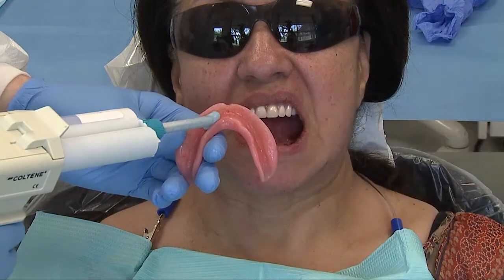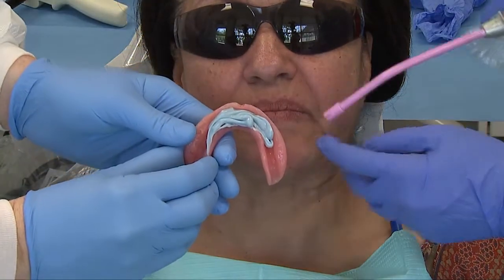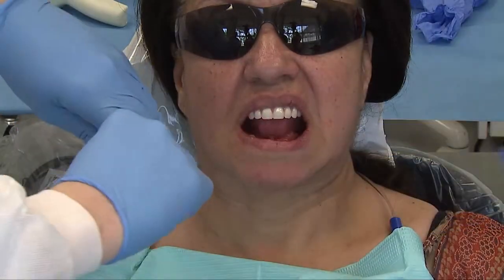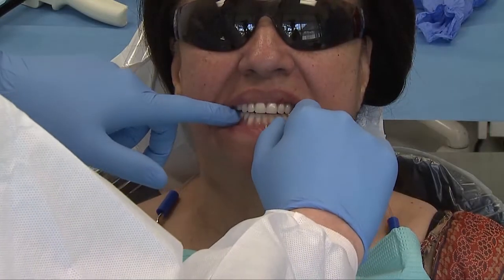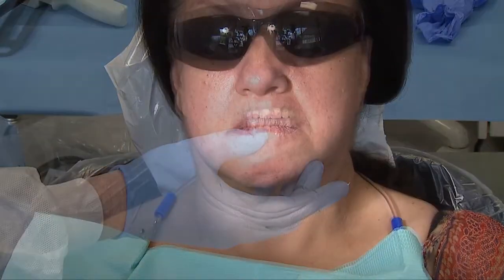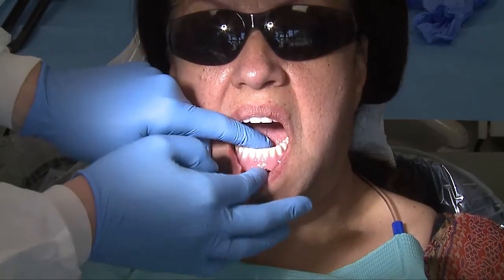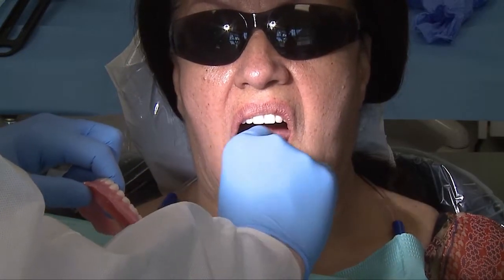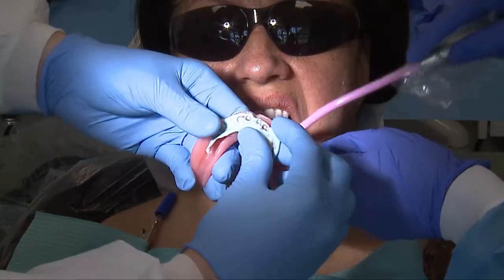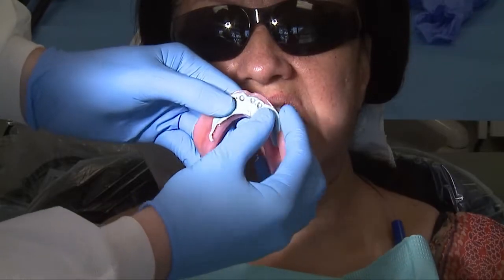I'm going to inject it into the area that corresponds with my locator abutments. Seating it, and have the patient bite down normally. Step number one: have her open, and this should be completely set. Sometimes it will stick — just like that. If it does pop out, no big deal. I pop it back in on the denture, and that's the position it will be correlated to.